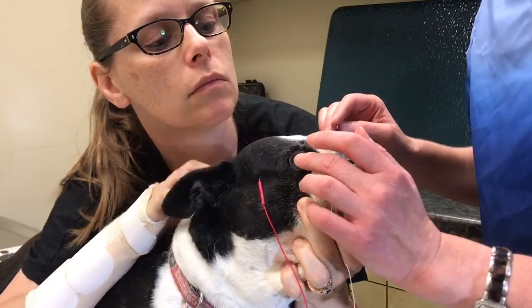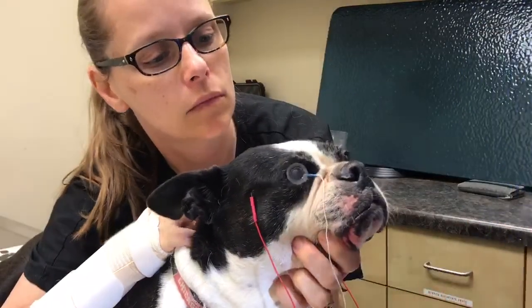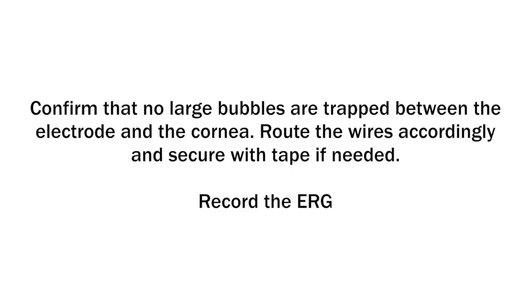Maintain gentle pressure on the front of the electrode for several seconds to ensure a good fit. Confirm that no large bubbles are trapped between the electrode and the cornea. Route the wires and cables accordingly and secure with tape if needed.